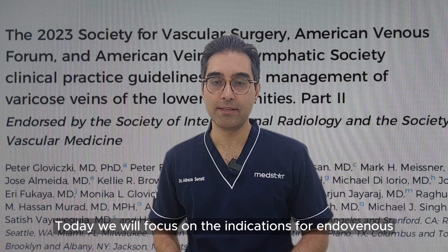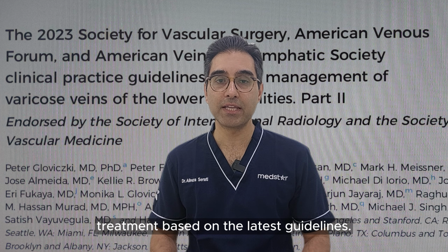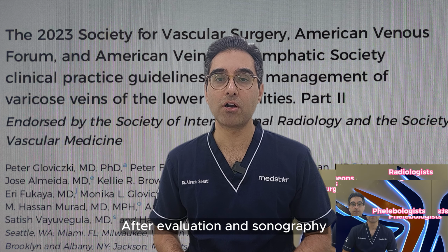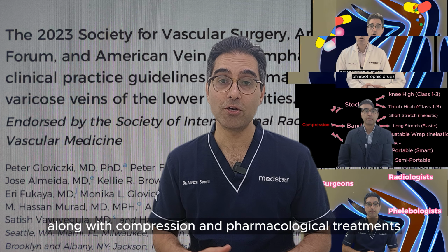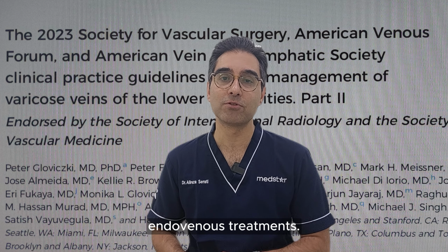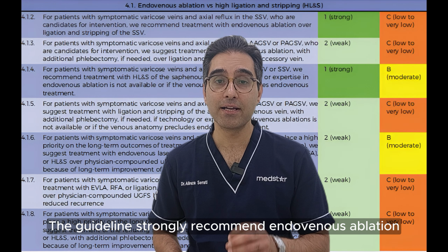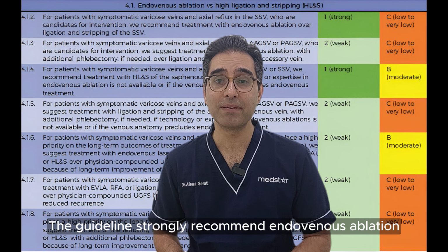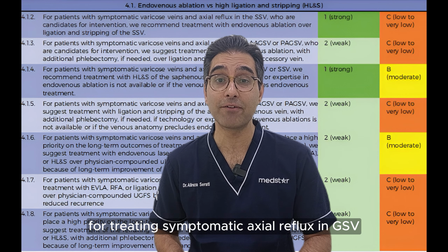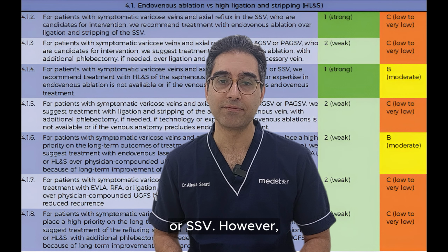Today we'll focus on the indications for endovenous treatment based on the latest guidelines. After evaluation and sonography along with compression and pharmacological treatments, it's crucial to understand when to perform endovenous treatments. The guidelines strongly recommend endovenous ablation or high ligation and stripping for treating symptomatic axial reflux in GSV or SSV.